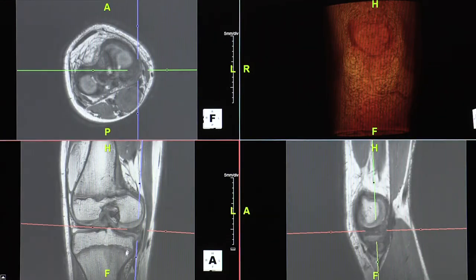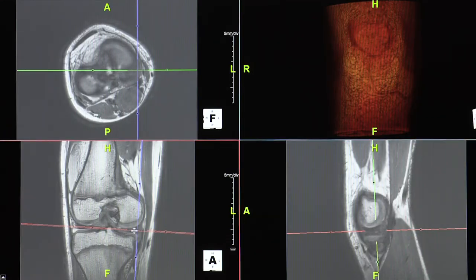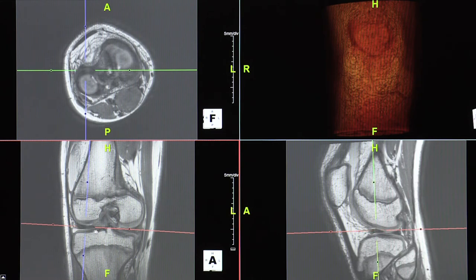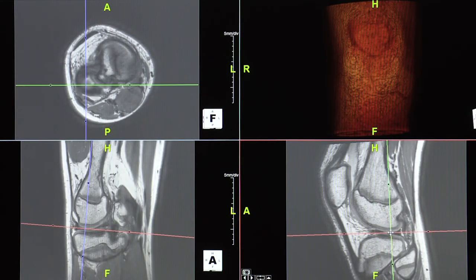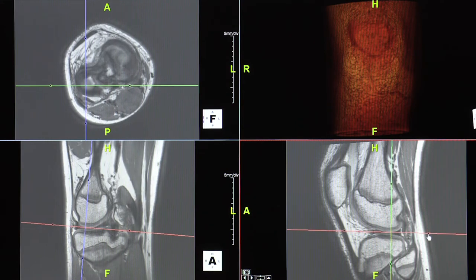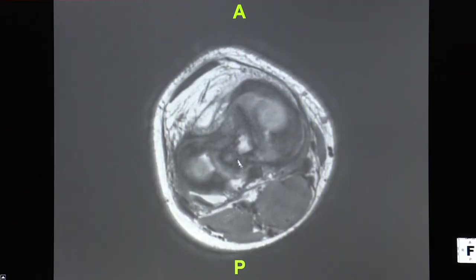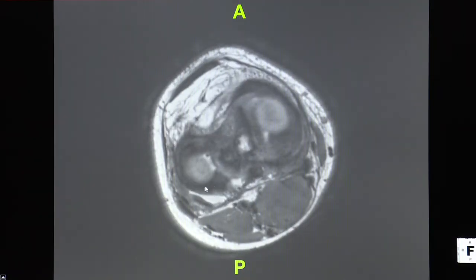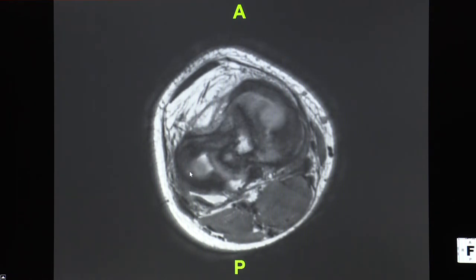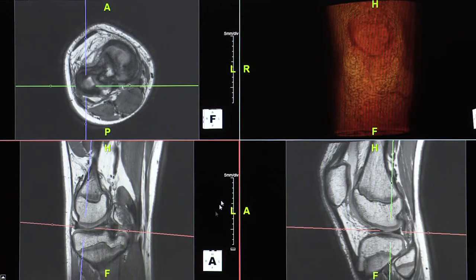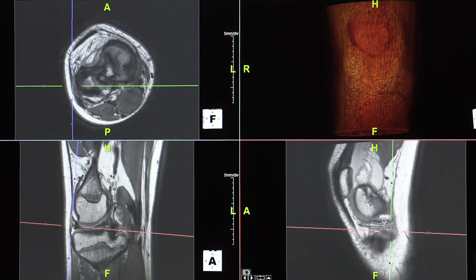The medial meniscus has some degeneration — that's why it looks a little grayish. Now for the lateral meniscus, I outline along the lateral meniscus and adjust its axis. This is the lateral meniscus — it has a small radial tear. If I change the windowing a little you can see that small radial tear more clearly.